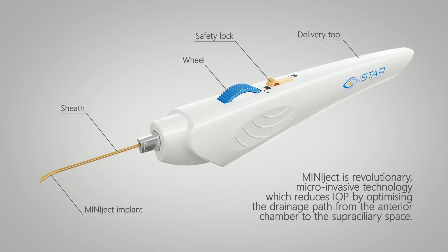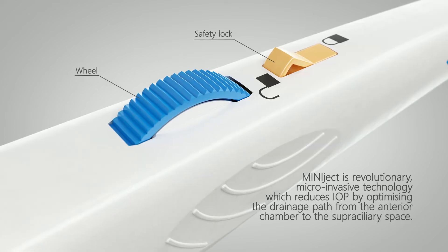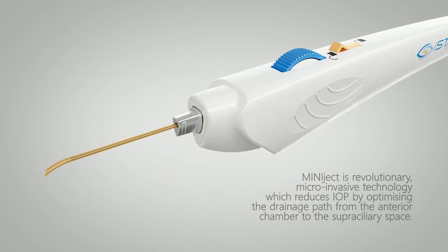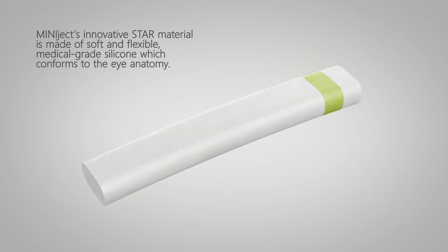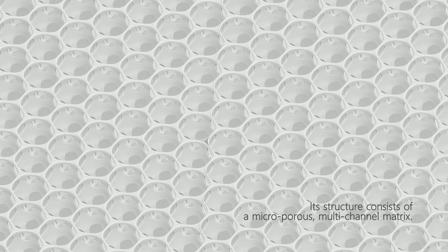Miniject is revolutionary micro-invasive technology which reduces IOP by optimising the drainage path from the anterior chamber to the supraciliary space. Miniject's innovative star material is made of soft and flexible medical grade silicone which conforms to the eye anatomy. Its structure consists of a microporous multichannel matrix.